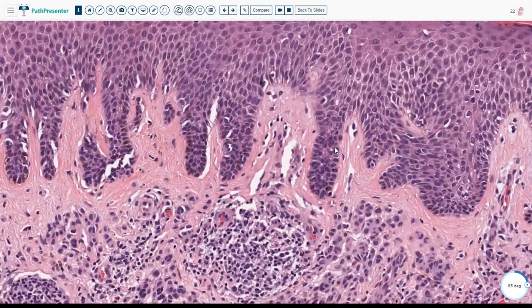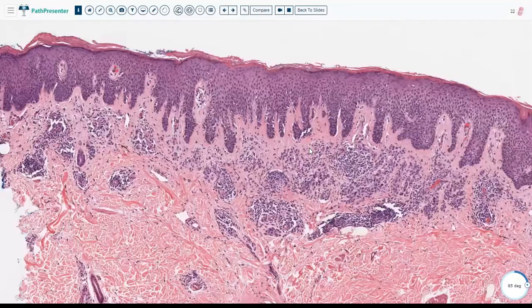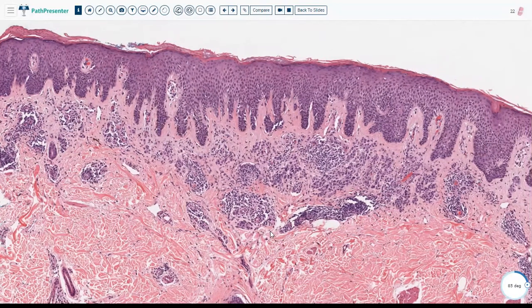So when you find a nevus that clinically looks red and itchy and there's spongiosis in histology, what kind of nevus do you call this? Meyerson's nevus, or just in English terms, an inflamed nevus. This is an important point you have to be aware of clinically, because we always say when a nevus or a mole looks reddish or bluish, we'll be concerned. This lesion can be red, itchy, irritated, and it might make us concerned. But in histology, it's very normal, it's in the dermis. But in the epidermis, there's all spongiosis. So sometimes we call it eczematous nevus or inflamed nevus or Meyerson's nevus, because everyone likes to put their name into a lesion.